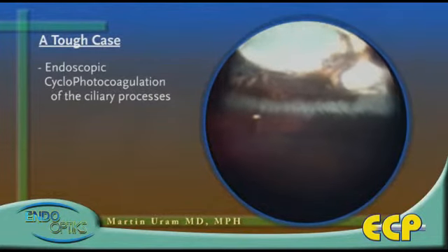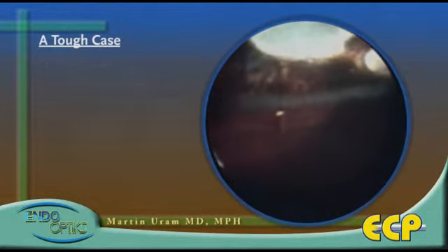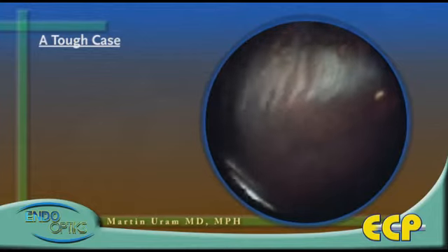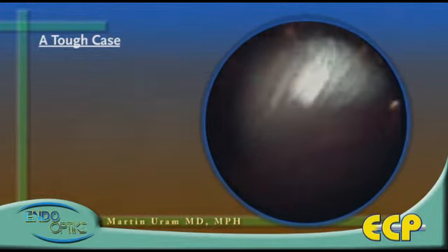Our goal is to photocoagulate 360 degrees of the ciliary processes in a fairly intense manner without causing explosions of the processes themselves.